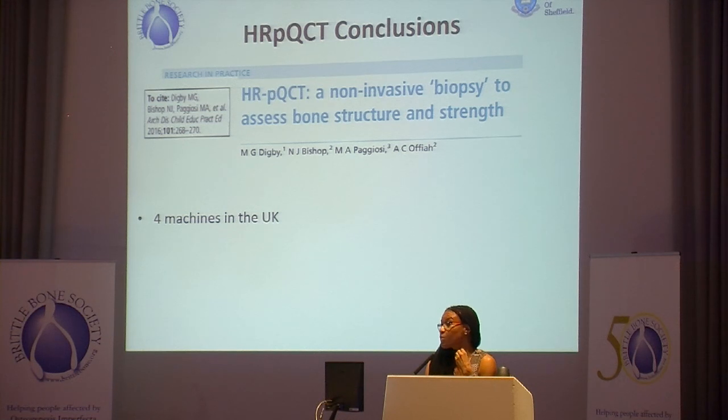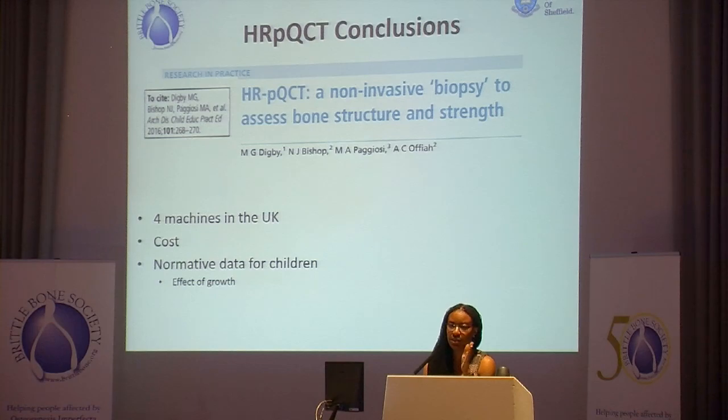And there were only 4 machines in the UK, which is why I say perhaps it will be implemented, although it's looking reasonable, it's not something that will be implemented widely in the next 5 years, maybe 10, 15 years' time. It's a fairly expensive piece of kit, and the normative data for children is going to be very difficult to develop because they grow.